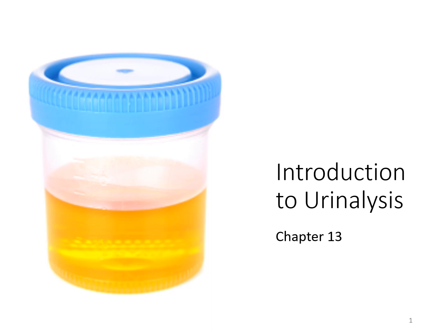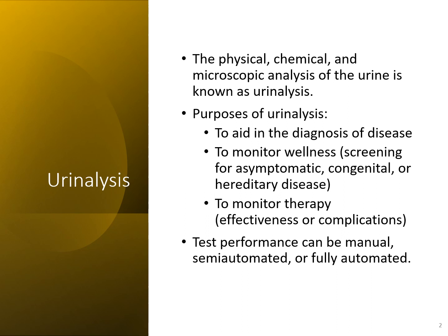Chapter 13, An Introduction to Urinalysis. Urinalysis is the physical, chemical, and microscopic analysis of the urine.